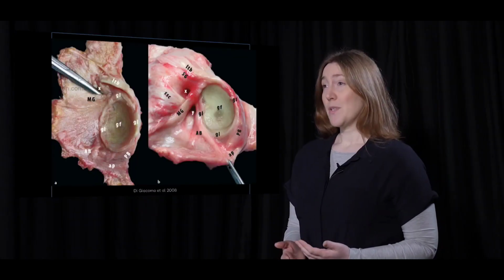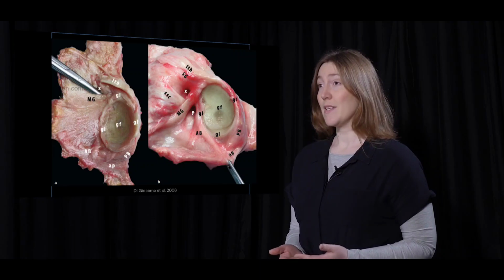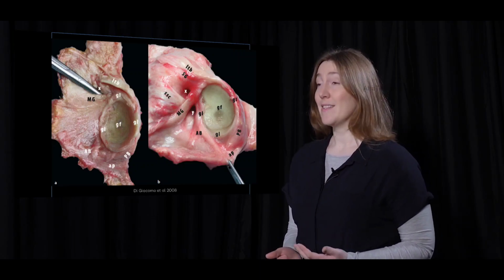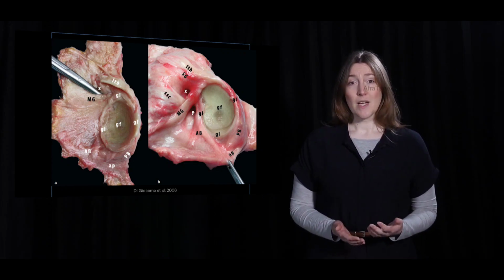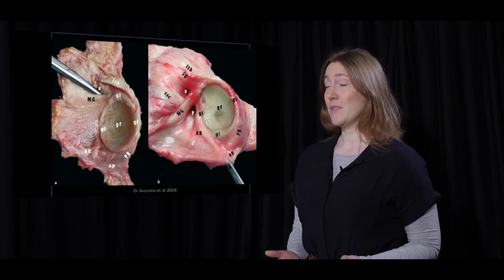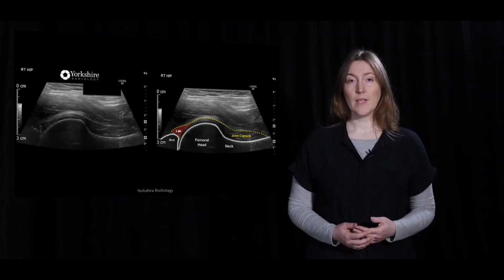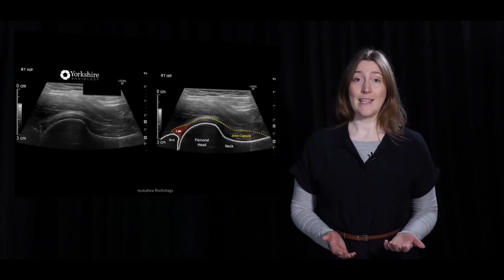The synovial capsule has two layers, the protecting fibrous membrane on the outside and the synovia producing synovial membrane on the inside. The capsule is reinforced with ligaments and sometimes tendons. It would be too simplistic to regard them all as separate anatomical tissues. They are, in most cases, interconnected. Just like bursae, the capsule in the anatomy is quite hard to see.